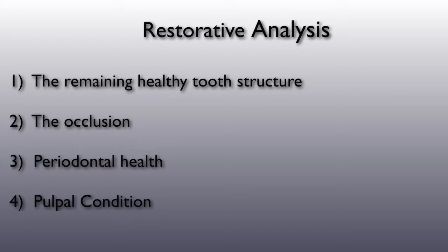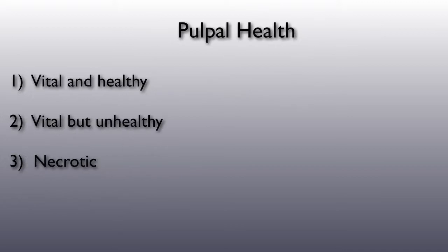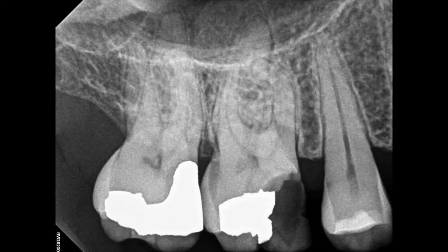Lastly, it is critical to understand the pulpal condition. A simple cold test can tell us if the pulp is vital and healthy, vital and unhealthy, or necrotic. In this case study, we tested the adjacent teeth to establish a baseline of the patient's thermal sensitivity. All teeth responded similarly to cold without lingering discomfort.